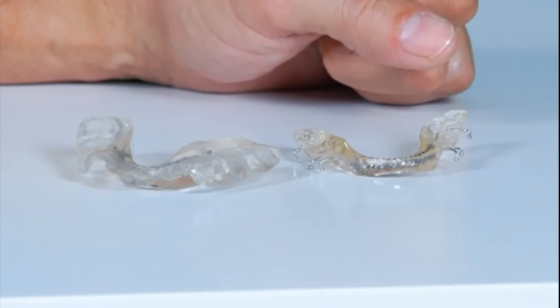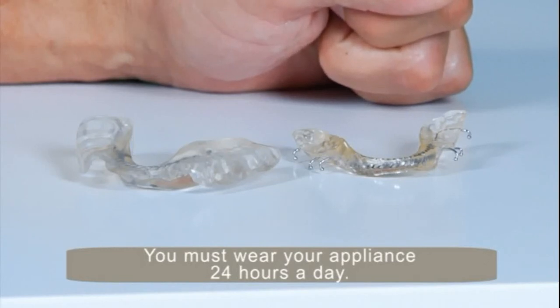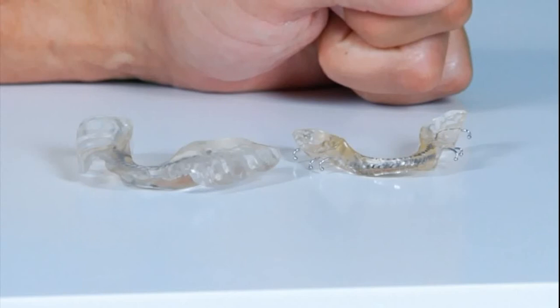The most important aspect of this treatment is that the patient must be able to learn to chew food with the mouthpiece, because this is when the most damage to the joint and muscles is being caused. One of the major problems that we see with other treatments today is the fact that some of these mouthpieces are made incorrectly. First, let's start with current treatment methods.